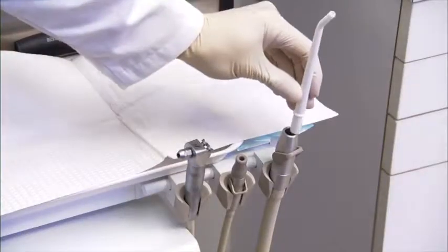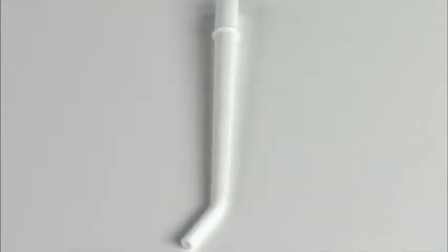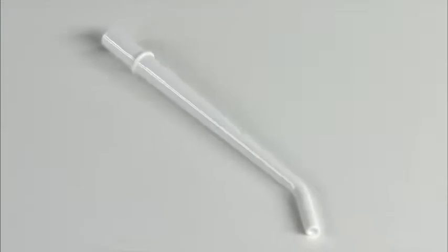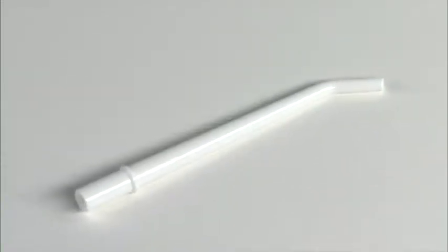Air and water setup is necessary for the procedure. A surgical suction tip is provided and should be used for gel removal at the end of each session to prevent disturbing the isolation material.